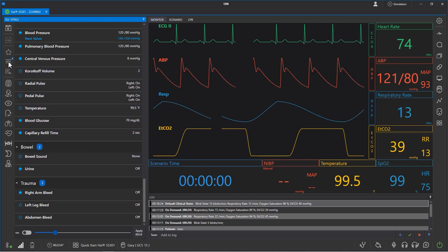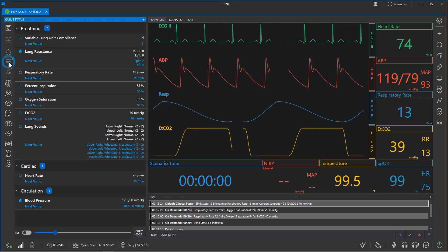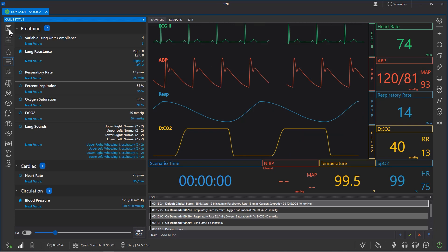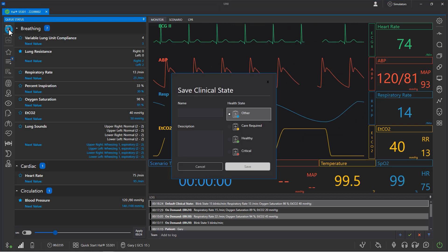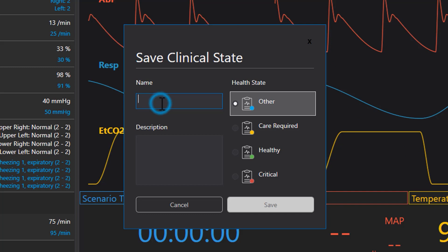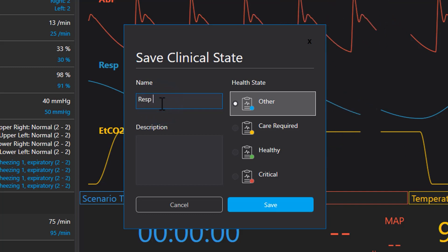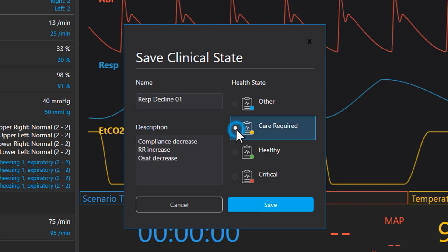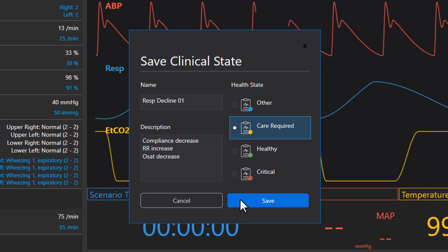First, fill the cue with all the desired vital sign changes for the clinical state, then press the save icon above the Cue menu. Give your clinical state a name, health state, and description to help you quickly identify it later. Press save when you are ready to add it to the Uni3 clinical state library.